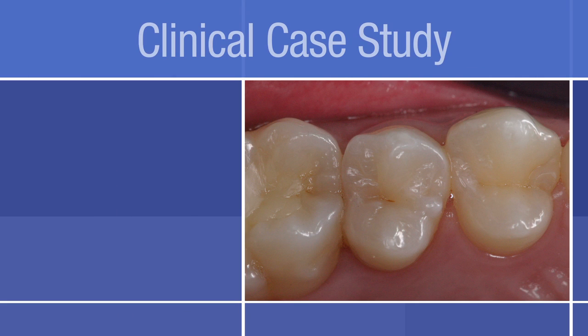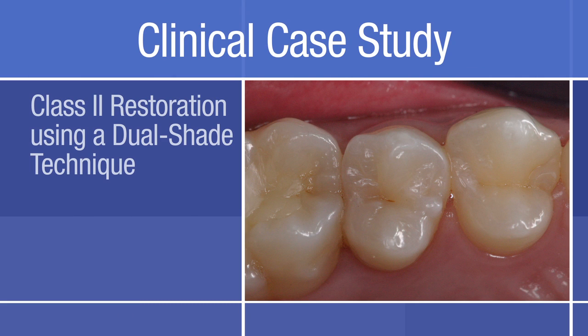This clinical case study demonstrates a class 2 restoration using a dual shade technique, courtesy of Dr. Aboudaram from France.